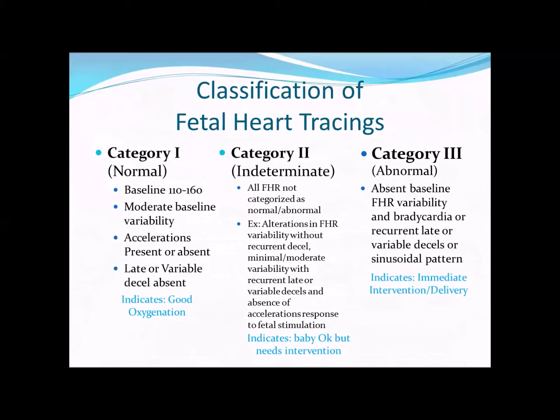Okay, so this is where you're going to sound really cool. If you haven't done your OB rotation, they all talk about categories of the fetal heart tracing. So we've got category 1, category 2, and category 3. One of the midwives did a really great job of explaining it to me, and I really liked it. She said basically a category 1 is normal. We've got a normal heart rate. We see variability. We've got accelerations. You can tell a good fetal heart strip. So that's just good.